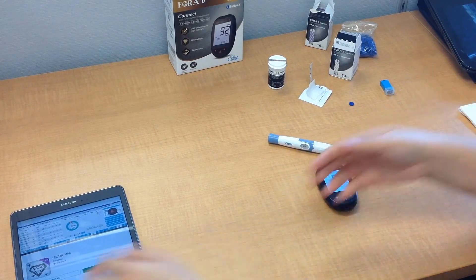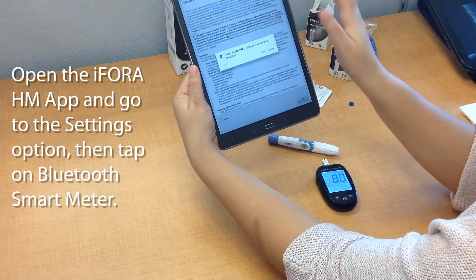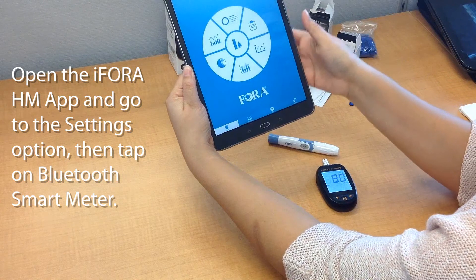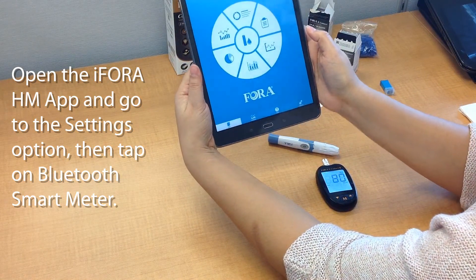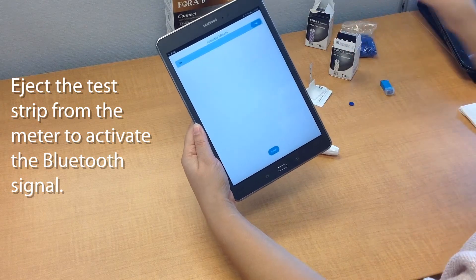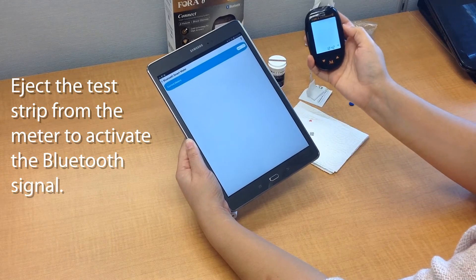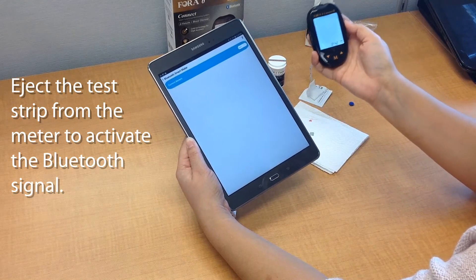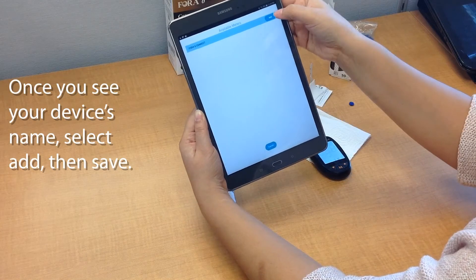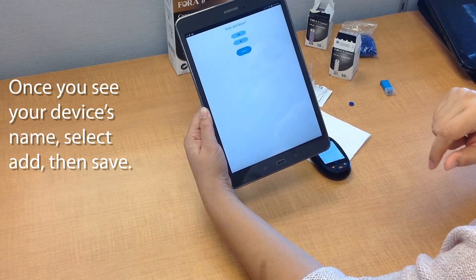There will be a countdown on the meter and you'll see a result right away. At this point, go ahead and open the iForaHM app that you downloaded — you'll need to do the initial app setup and agree to the terms before you can open it. While it's open, go to the settings tab and then go to Bluetooth smart meter. Take your meter and eject the test strip by pushing on the eject button. This will turn it off, but it will also turn on the Bluetooth signal on the meter, which will allow your app to find it. Once you find the name, go ahead and select add and then go back. It'll ask you if you want to save or leave — you want to save.